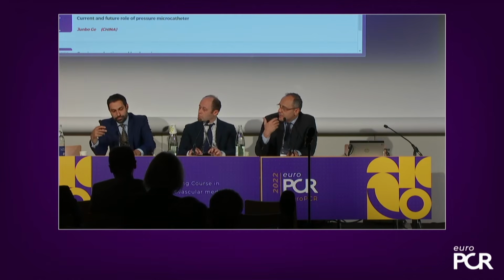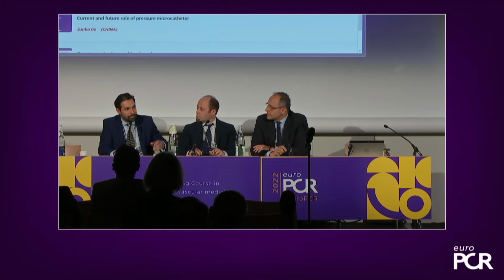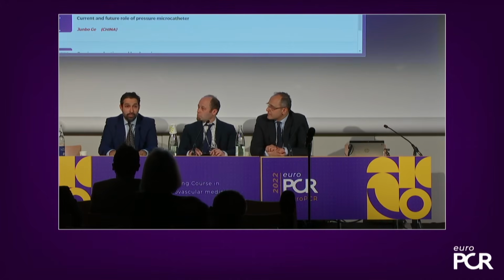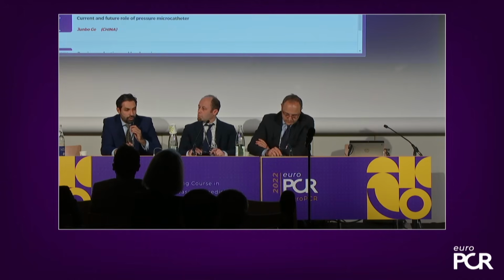Is this something we should expect more and more, we should look for more and more? When you do these type of cases and you use physiology the way you have used it, we try to recollect all the cases that we have done with the old strategy and what would have been the result of those where we didn't use post-PCI physiology. So this is the first remark. And what you have seen is something very simple to understand from the fluid dynamic perspective. You have eliminated one stenosis, the flow has increased through the vessel, and it unmasked a second stenosis that was not visible because of the reduced flow when the first lesion was present. And this is one of the reasons why I think repeating the hyperemic functional assessment is very important to understand the degree of functional revascularization that we have achieved.